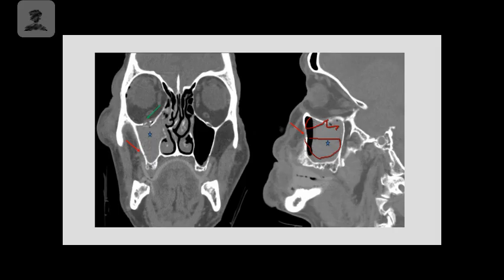We also have a coronal image over here. So with this patient, you can definitely see that they have a lot of fluid involved. One thing to point out is that you can see that there is a fracture of their orbital area. So right here, there's also a fracture over here. Depending on the situation, this could be a tripod fracture where the bottom of the orbital rim area is actually going to be broken, and some of the contents will spill out into the maxillary sinus. And so that might be what is occurring here.